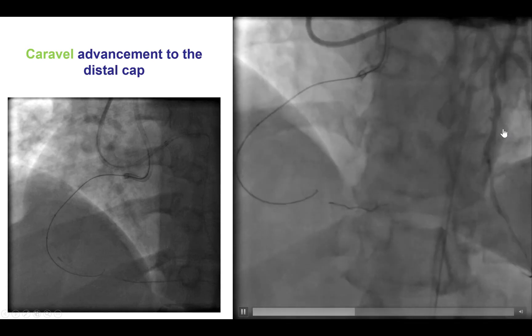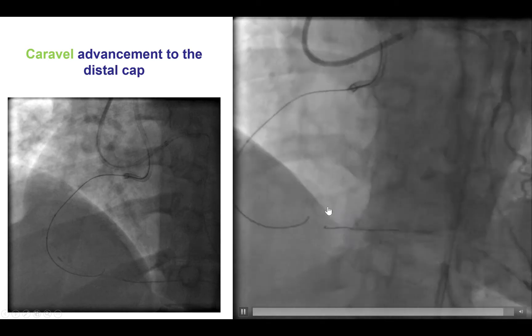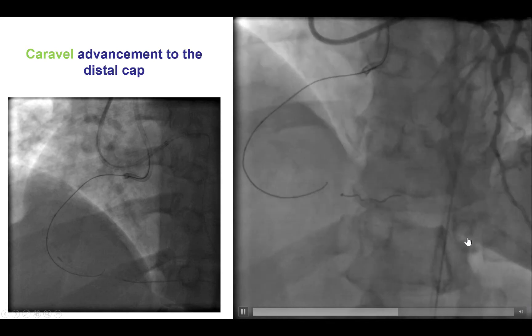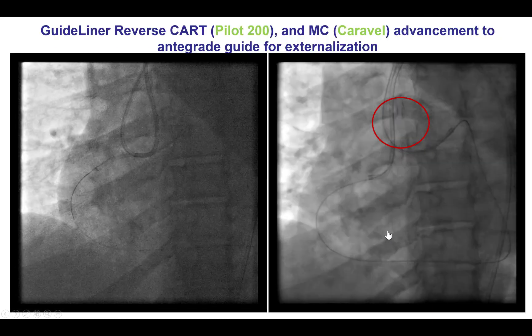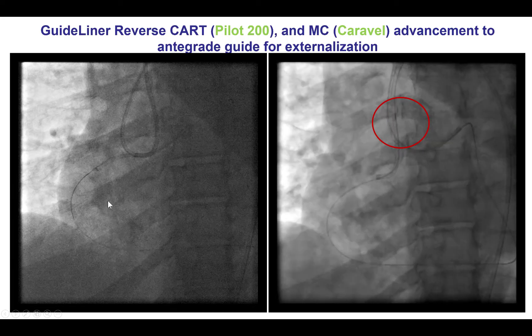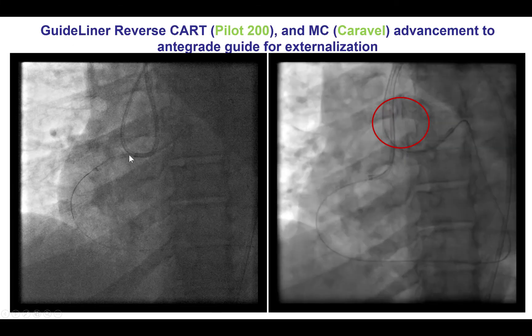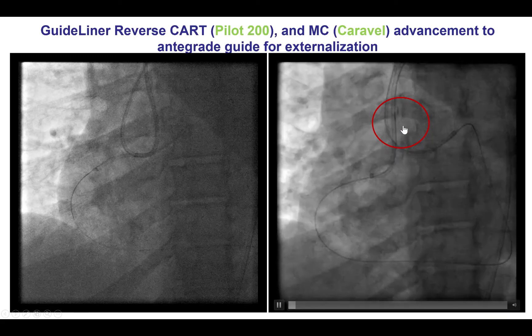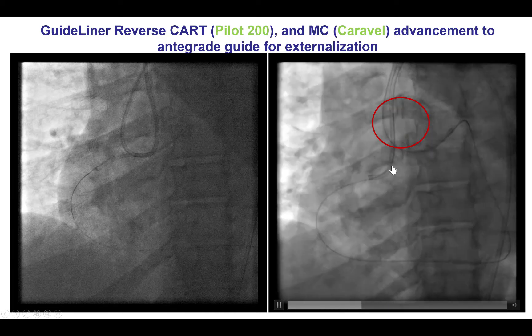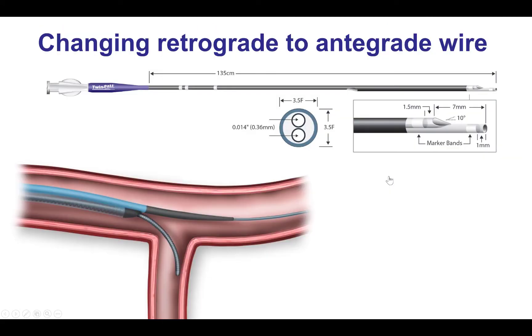This was confirmed by injection through the retrograde guide catheter — a key step before advancing the microcatheter through the collateral. We were then able to advance the Caravel through the collateral all the way to the distal and mid-right coronary artery, and then performed GuideLiner reverse CART by advancing the retrograde guide wire and microcatheter all the way into the antegrade guide catheter, which had been changed to a JR from an Amplatz, as the JR is easier to use for externalization.